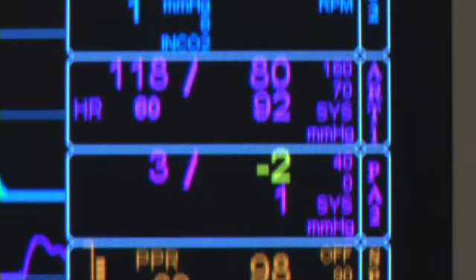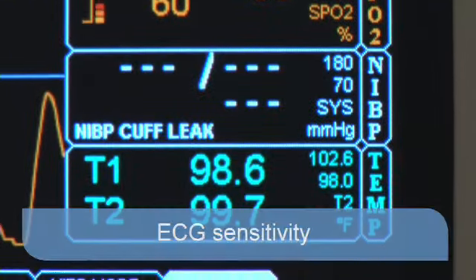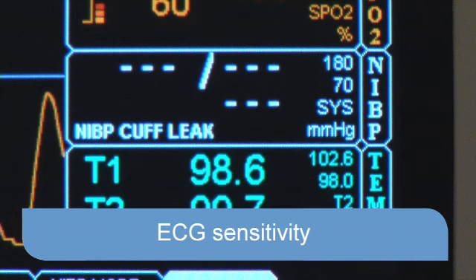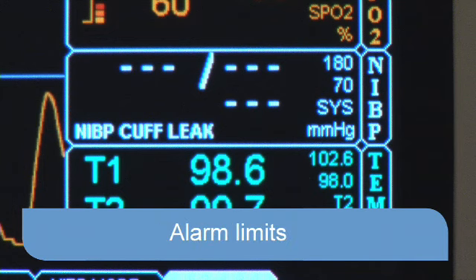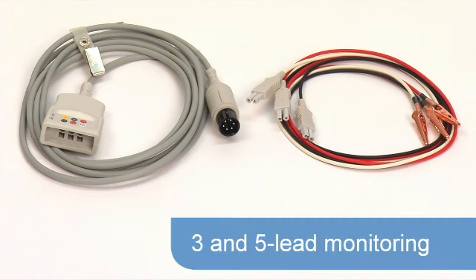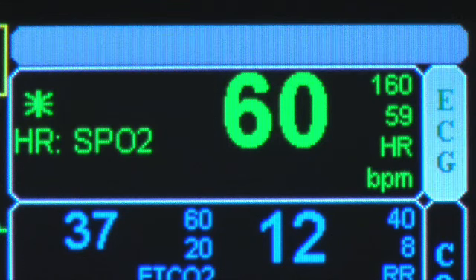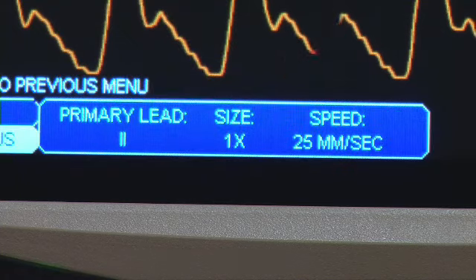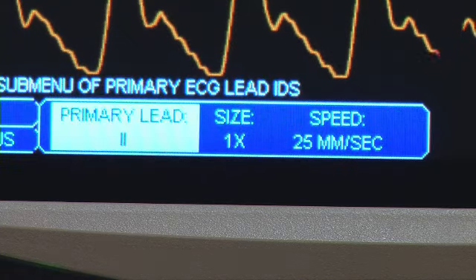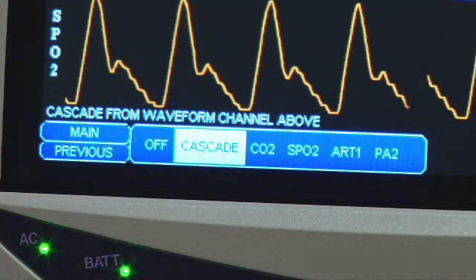The Monitor features three monitoring modes that adjust ECG sensitivity, cuff inflation pressure, and alarm limits, allowing it to be tailored to the physical requirements of the patient. The ECG parameter has both three and five lead monitoring capabilities, with options to select lead-specific viewing, amplification of lead signal display, and ECG cascading.